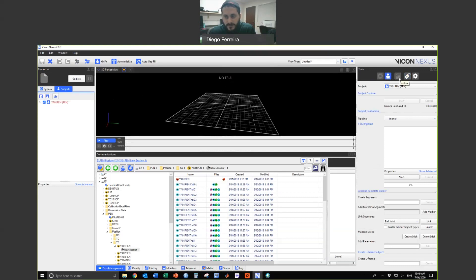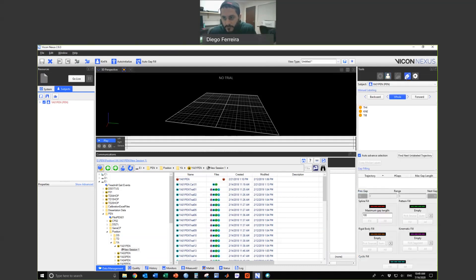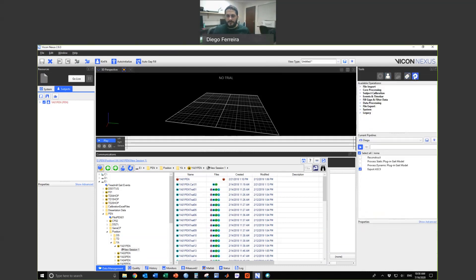Over here are your Tools — this is where you can add information to your subject if you were collecting data, but we won't be able to do so here since we're not on the capture computer. Here's the Labeling section, where you would attach markers to the reconstruction. This pipeline or settings icon is where you can run different pipelines — reconstructing data, processing data with different techniques, and exporting data.